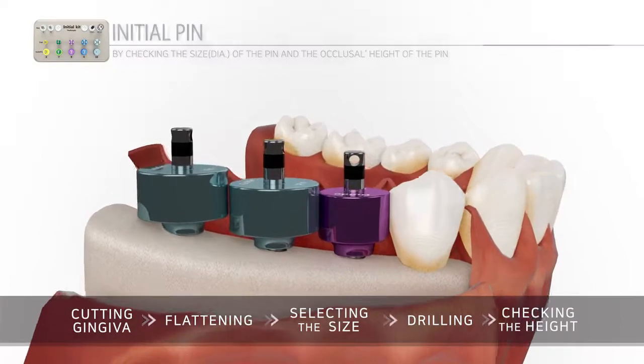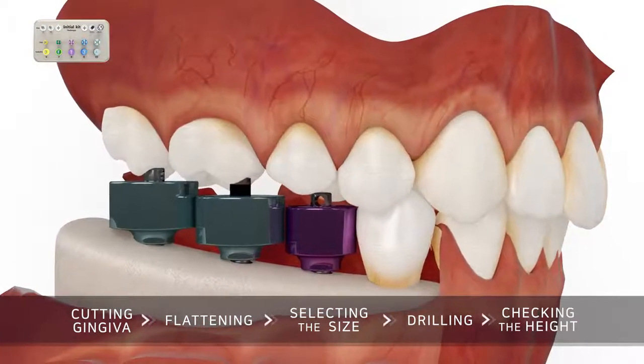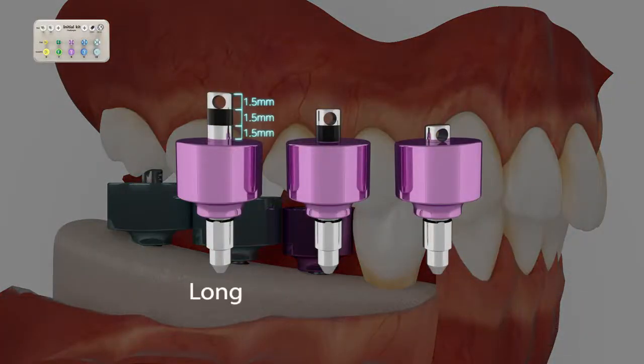Have the patient bite on it and visually check the height of the pin remaining after being pushed in by the opposing teeth. This will determine the height of future fixtures and abutments.